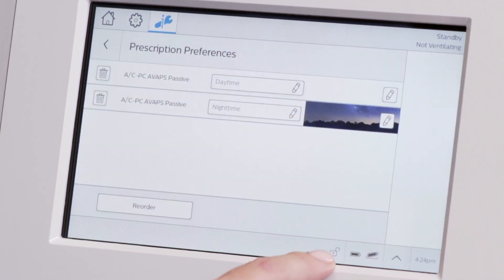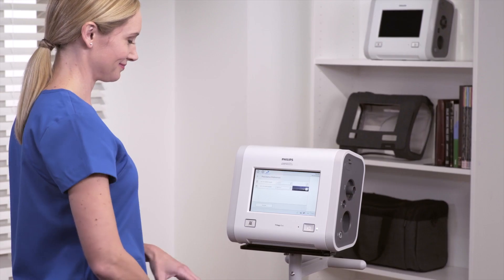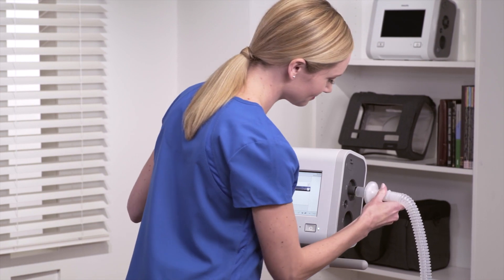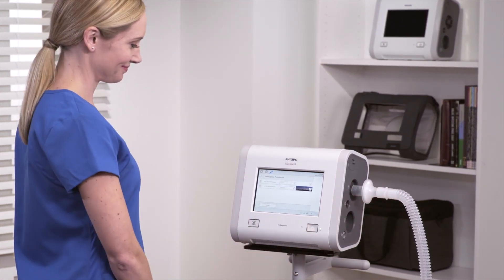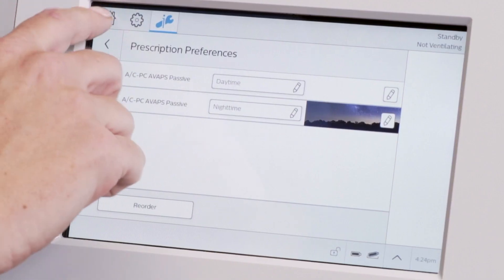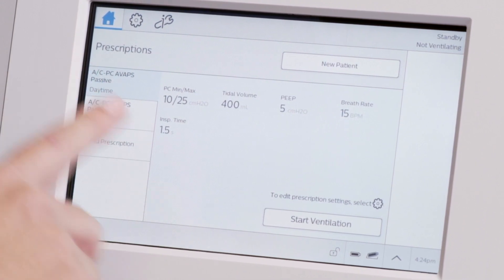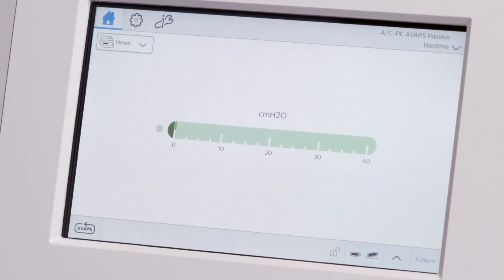Since we are still in full access mode, the unlock icon is displayed. To start ventilation using the daytime prescription, be sure to have a circuit in place. Press Home, Daytime Prescription, and then tap Start Ventilation.